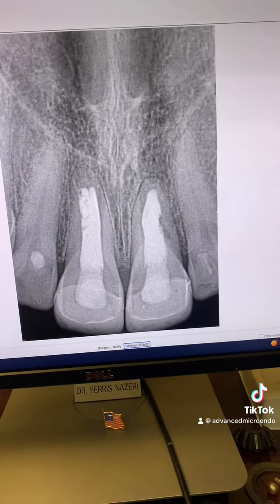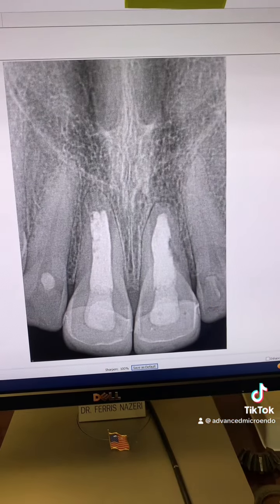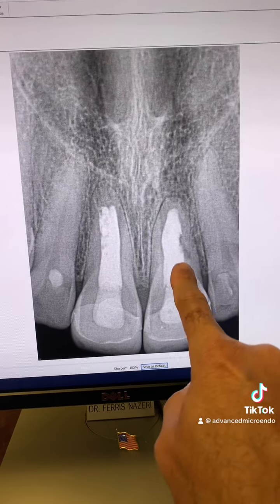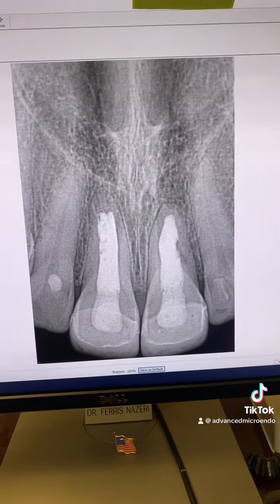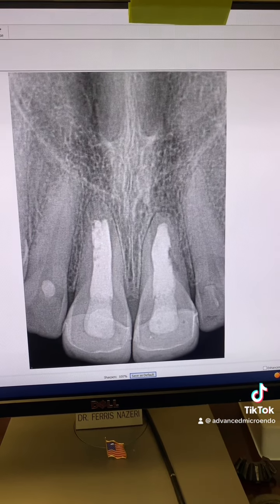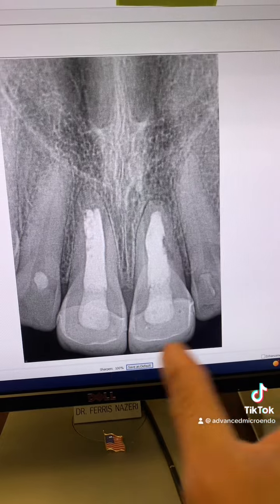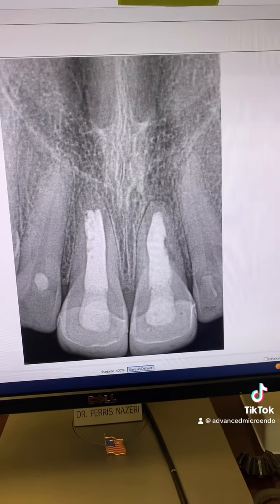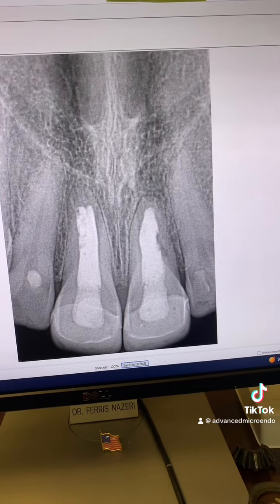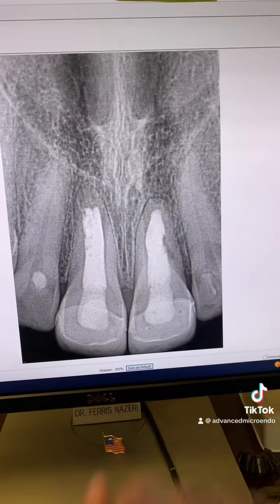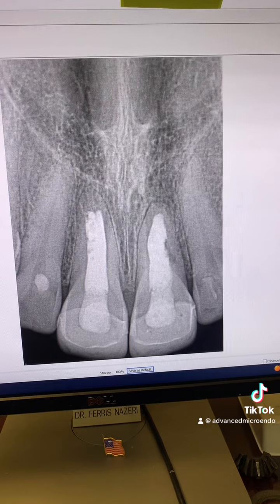We discussed options with the patient. We can try to see if we can save this tooth — go ahead and redo the root canal, remove all of this gutta-percha. As you can see, there's tons of it. Then fill the whole canal with MTA and see what happens — no promises or guarantees, we'll do our best. Only time will tell. Sometimes the body doesn't stop rejecting the tooth; the immune system just constantly eats away at it. Sometimes we can fool the immune system into believing this is the patient's own tooth by removing the irritant and cleaning out the infection.